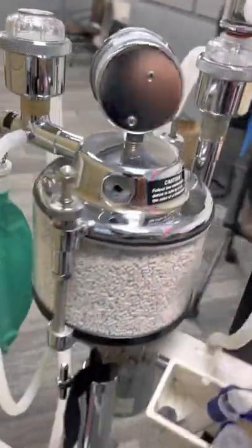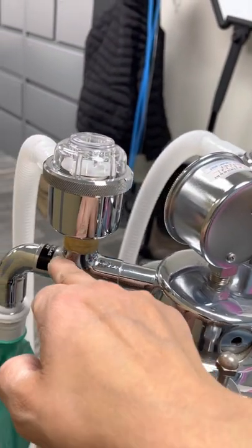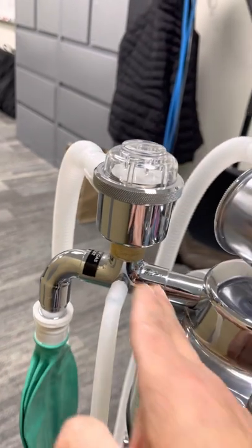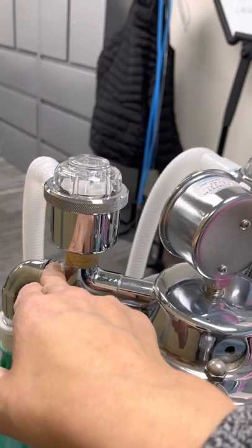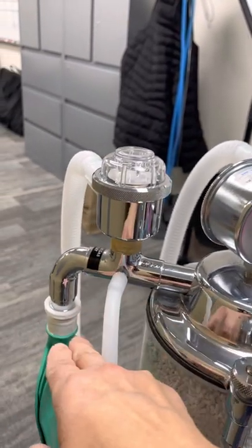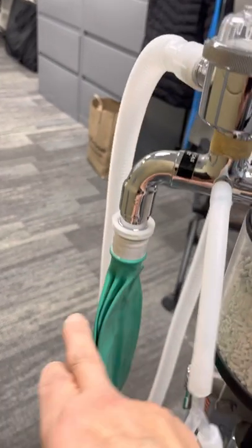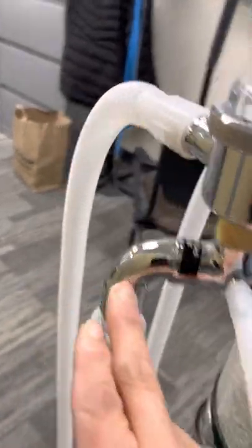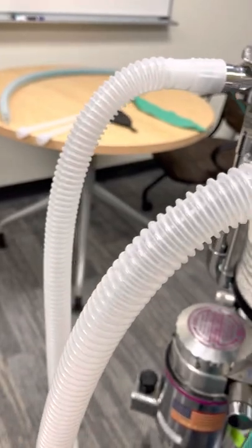Then once it passes through here, it's going to come back up and into our reservoir bag. So that's where it's going to be stored. It's still good gas. It can still be used. All the CO2 is taken out of it, so the animal's not going to rebreathe that. So the animal then, when it breathes in again, that from the reservoir bag or rebreathing bag, it'll come back up into our Y tubing and go back to the animal.